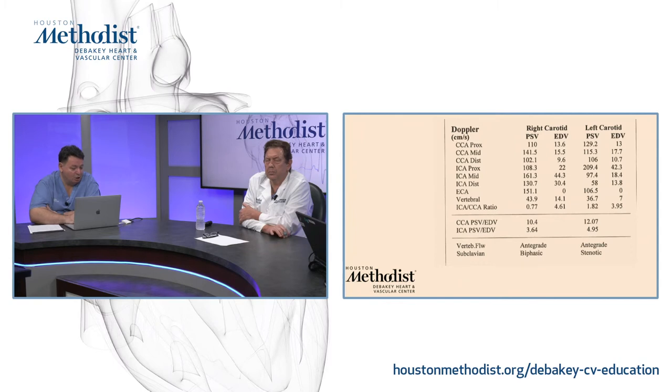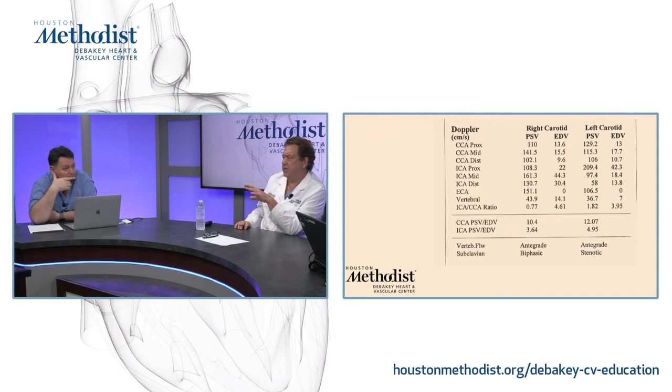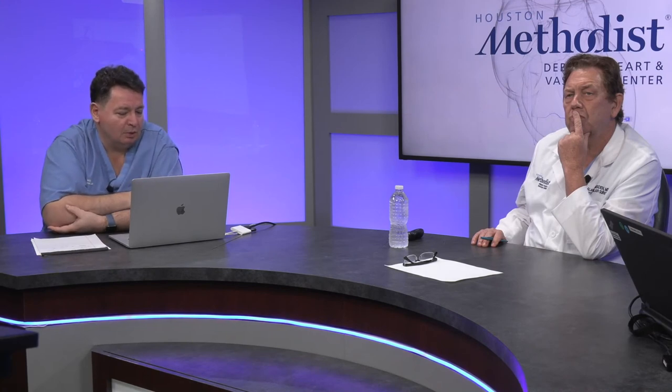in the setting, but the only problem is that this is a mid increased velocity. So this is a mid ICA, not a proximal. So quite often when you see the mid increased velocities, those are maybe a tortuosity after the origin, and the criteria apply. But I don't know what mid ICA is. I mean, we all know that most of this disease is at the origin. Mm-hmm. So what's mid? Is mid 2 to 3 centimeters beyond that? I cannot tell in centimeters, but it's definitely about the range of 2 centimeters for sure. But I think it's just the visualization of the whole cervical ICA, what we can scan.